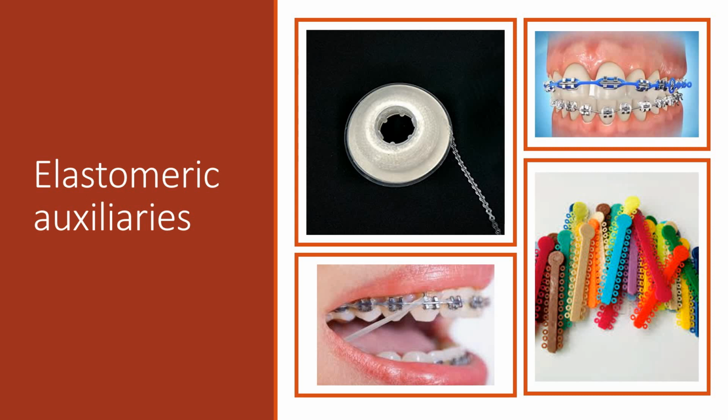This includes small elastomeric ligatures to hold the arch wire within the bracket slot, lengths of elastomeric chain, which can be stretched and used for moving single or multiple groups of teeth, elastomeric thread for the application of traction to individual teeth, elastomeric tube for covering exposed sections of an arch wire, elastic bands for application of intermaxillary force, and more robust extraoral elastic for headgear.